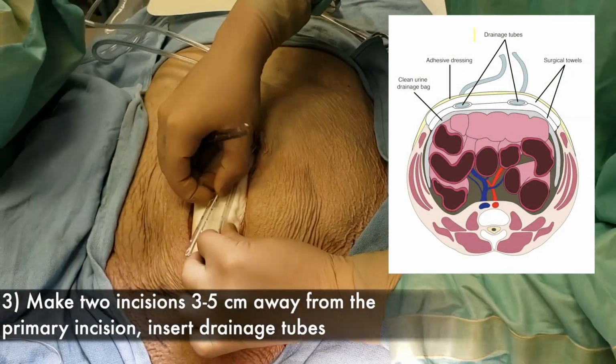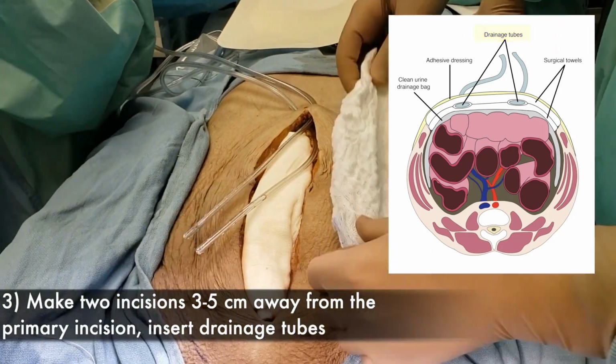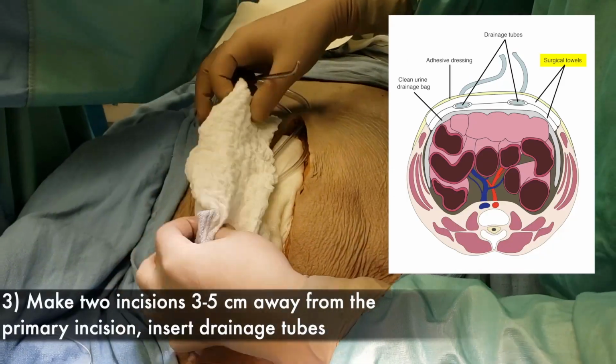Lay the 2 drainage tubes over the surgical towels filling the abdomen. Cover the drainage tubes with another surgical towel.